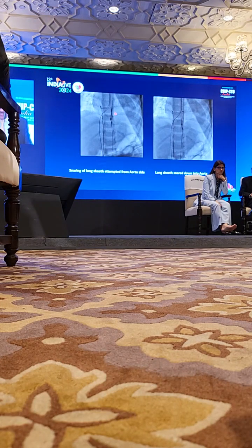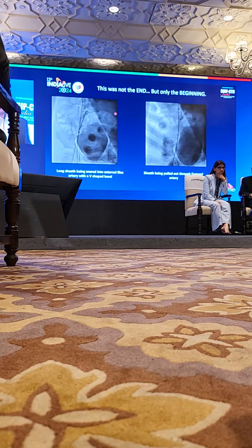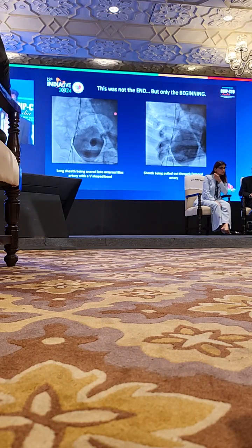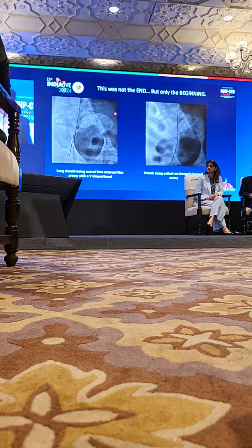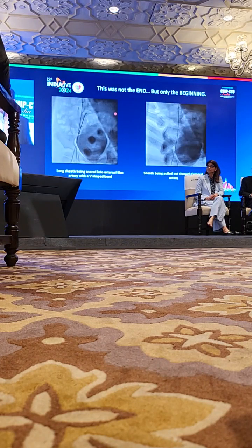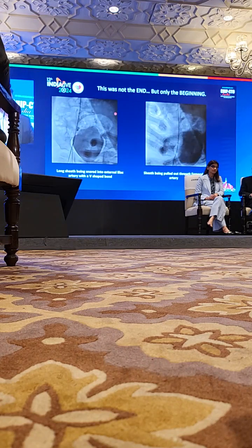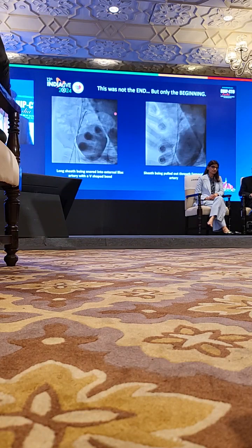So with a little traction, I could pull back the long sheath into the common iliac artery. This is when immediately the hemodynamics improved, and I was just wondering what to do next. So sometimes over enthusiasm. It was already late in the evening. It's difficult to call back the surgeon. So I thought it'll be a photo finish if I can complete this percutaneous retrieval of the catheter.